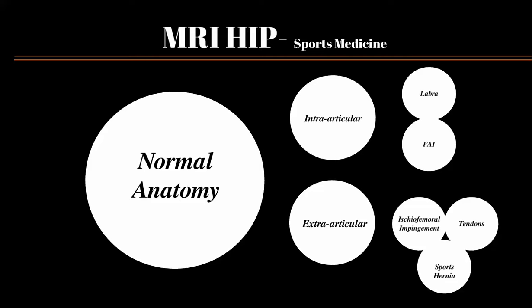Hi, I'm Dr. Pathak. I'm a consultant radiologist at Barts Health, Whips Cross Hospital. I'm going to talk to you about MRI of the hip with a slant on sports medicine related pathology.